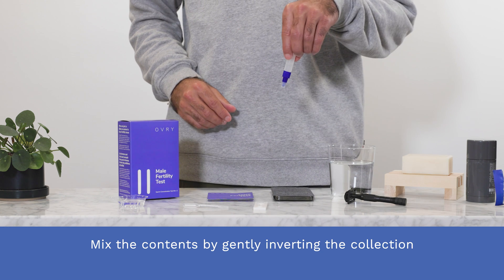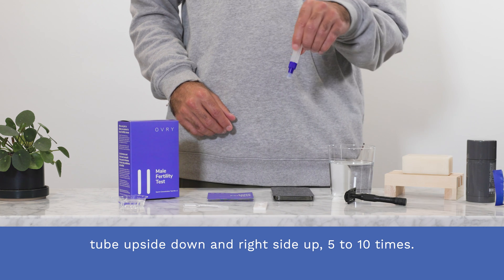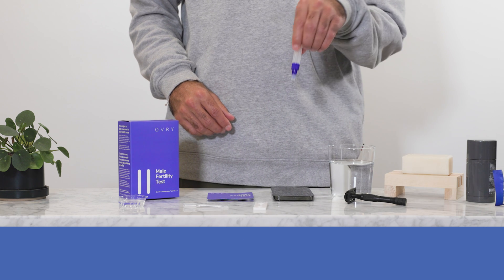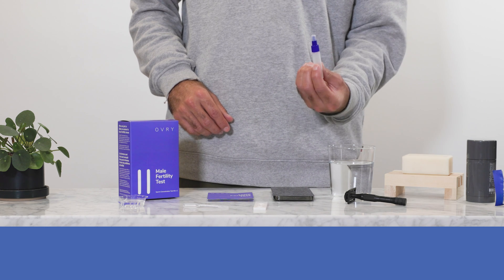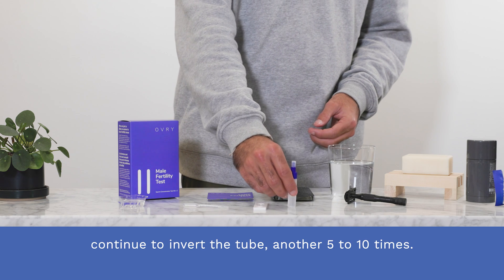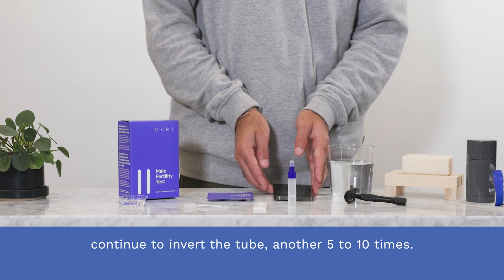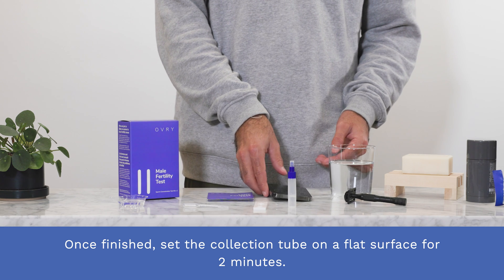Step five. Mix the contents by gently inverting the collection tube upside down and right side up five to ten times. Do not vigorously shake the tube. If the sample is thick and gel-like, continue to invert the tube another five to ten times. Once finished, set the collection tube on a flat surface for two minutes.